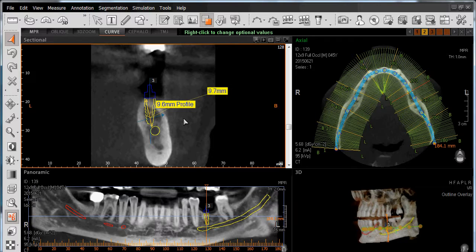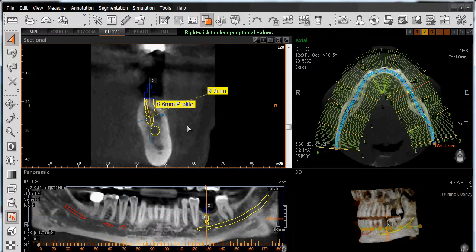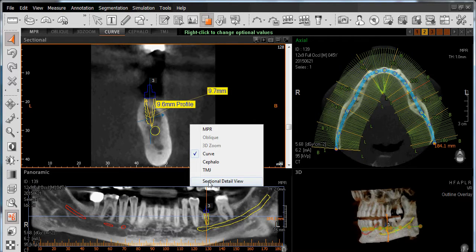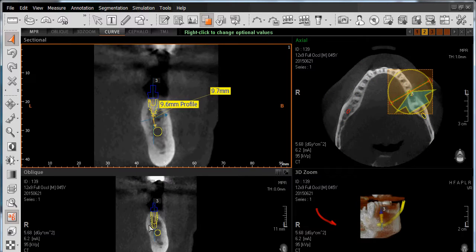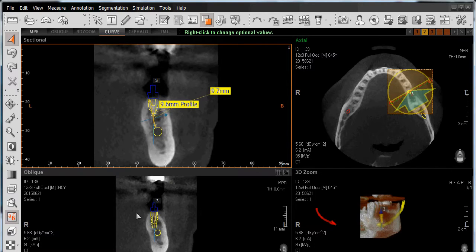We can also verify the placement of our implant as it relates to two adjoining teeth or to the cortical plates. By right-clicking your mouse anywhere other than the implant, we have an option called Sectional Detail View. This will change our layout by removing the panorama view in the bottom left-hand corner with an oblique view, and replace the 3D view with a 3D zoom view showing the area where the implant will be placed. Left-click on Sectional Detail View and we now have a cross-sectional view of our implant. In the upper right-hand corner in our axial window, we now have a line showing where we're looking at our implant, in this case looking posterior to anterior.